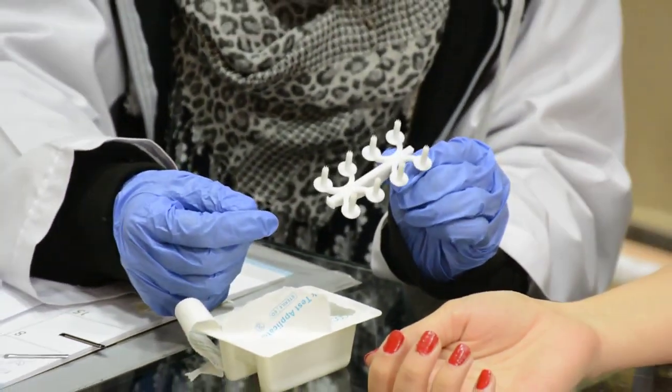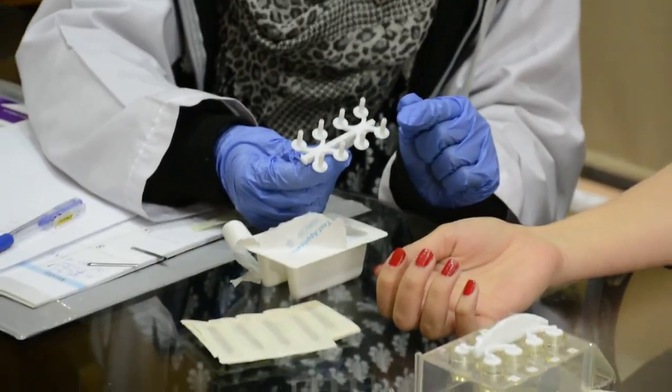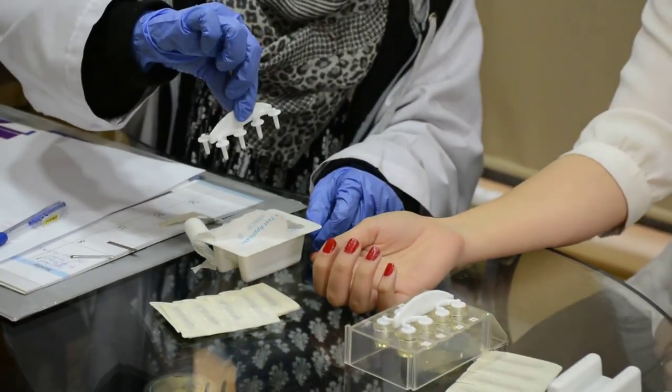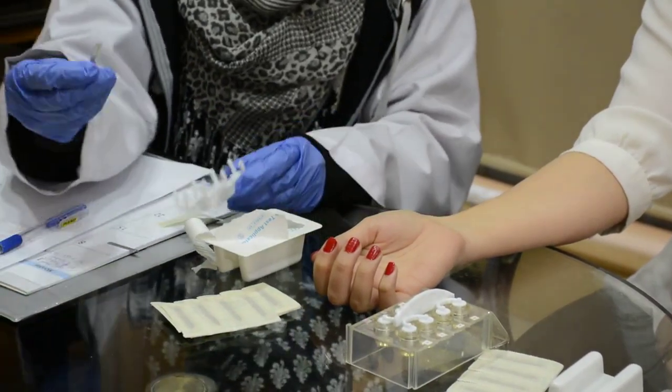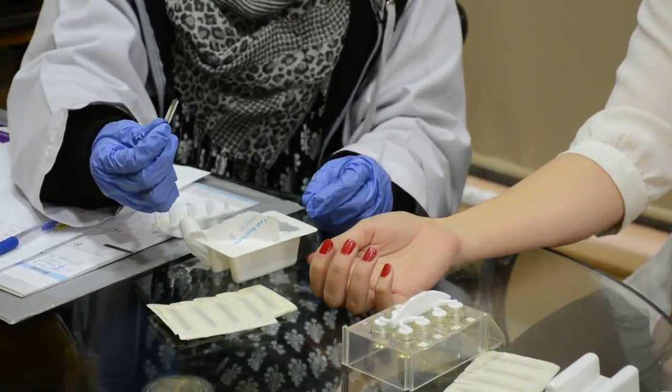We can do 8 different allergens with only one press which is painless, as compared to the old technique where the skin has to be pricked with the painful lancet 8 times.